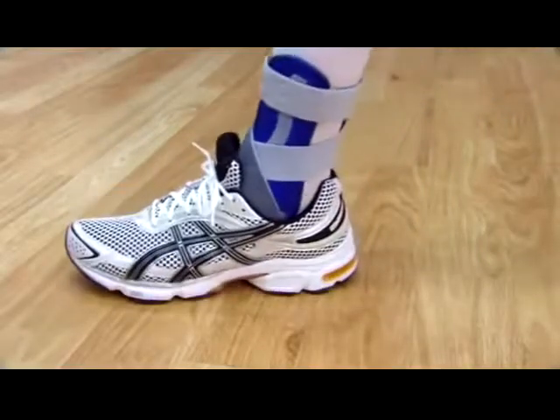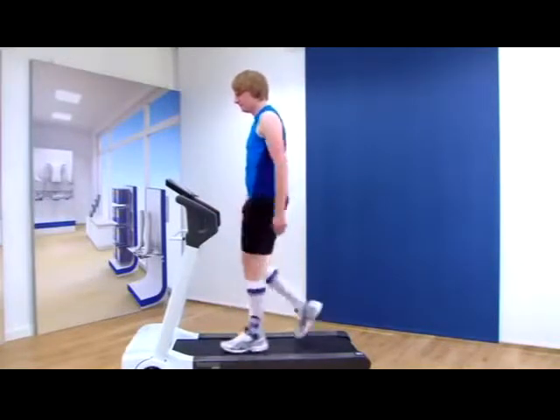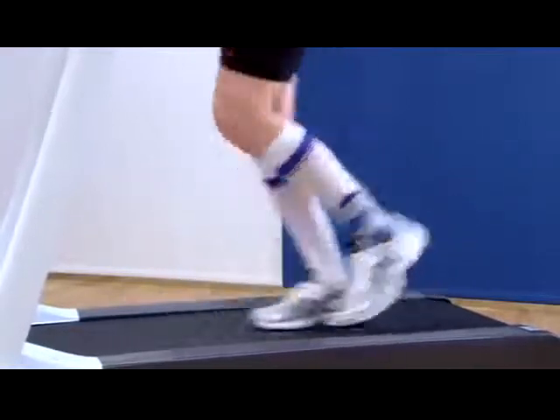The Malleolock can be worn comfortably in shoes. Its anatomical shape ensures maximum wearing comfort even during sports. The Malleolock stabilizing orthosis from Bauerfeind provides optimal stabilization of the ankle joint.